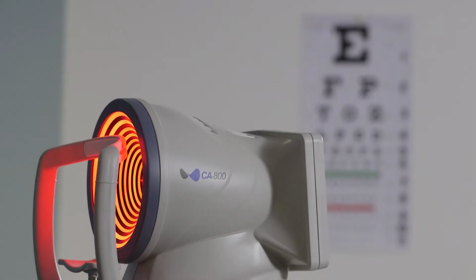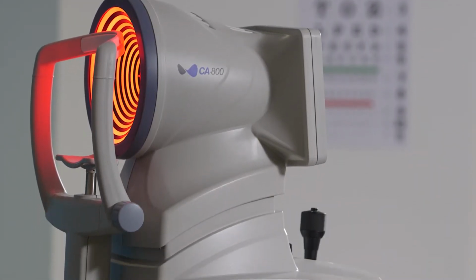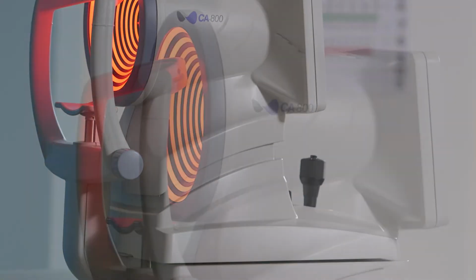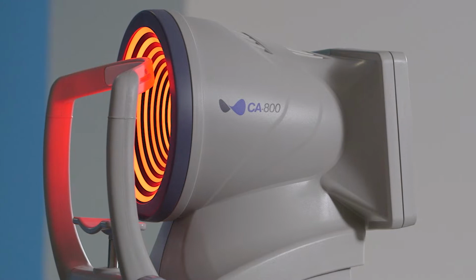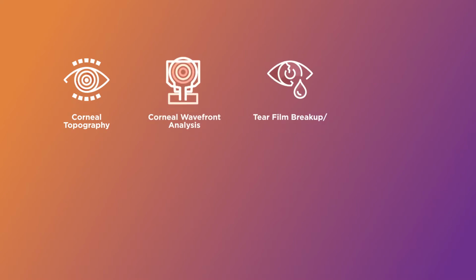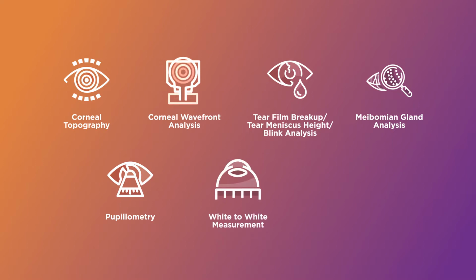Topcon CA-800 Corneal Analyzer combines corneal topography with a suite of dry eye analysis tools to enable complete evaluation of the anterior surface and tear-related structures. This multifunctional device offers topography, corneal wavefront analysis, tear film breakup time, tear meniscus height measurements, blink analysis, meibomian gland imaging, pupillometry, white-to-white measurements, and contact lens fitting software.